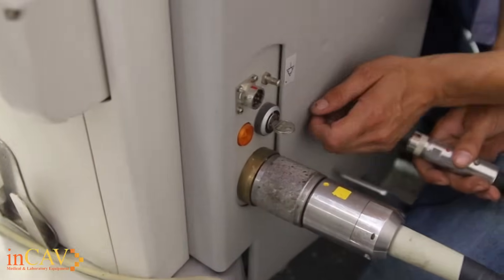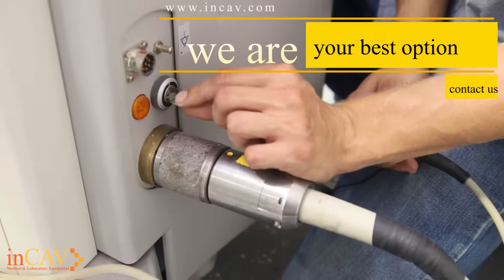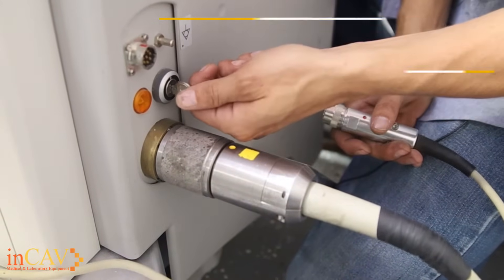Here we have the key for the C-arm unit itself. It's in the on position here and the off position here. Of course, in order to actually use the machine, you have to have it in the on position.